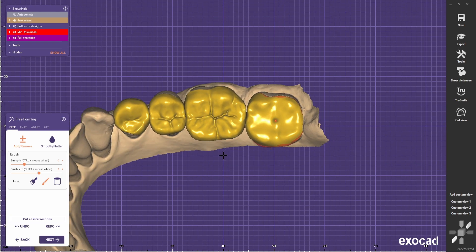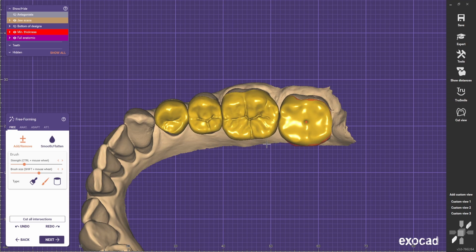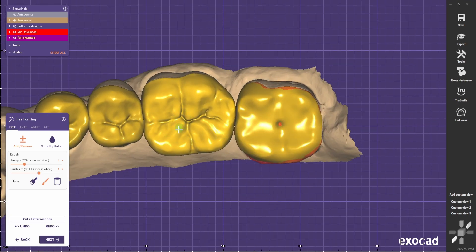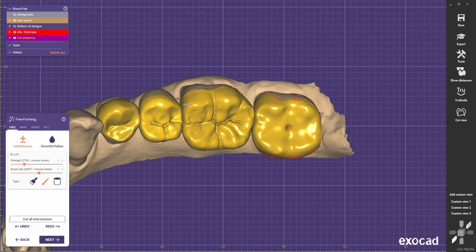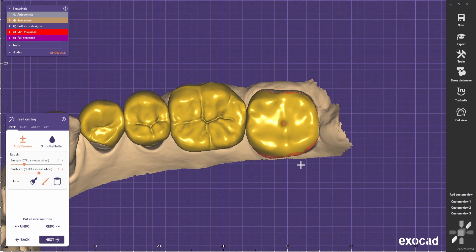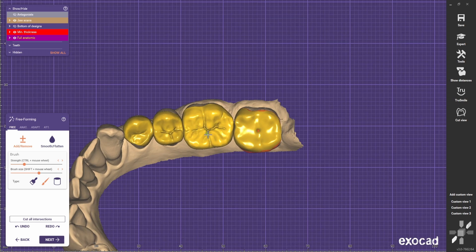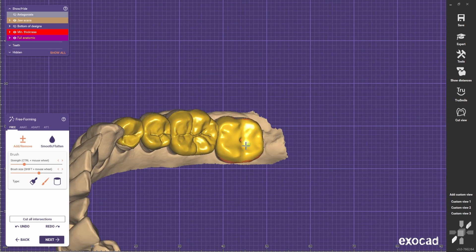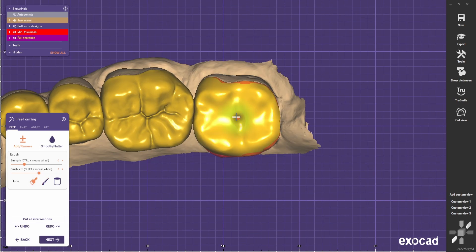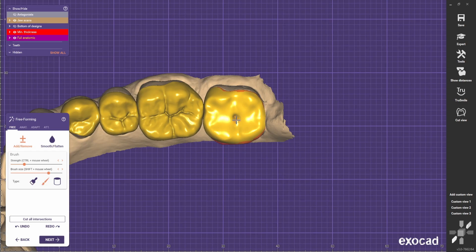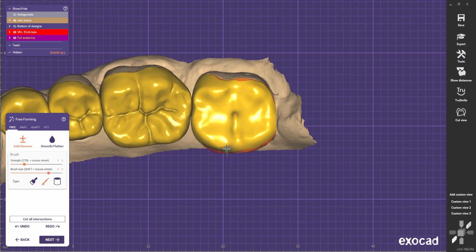Every time you do a lot of occlusal surfaces and occlusal tables, you kind of learn these rules. If you watch my videos and you know someone that is struggling with posterior morphology, share this video with them.